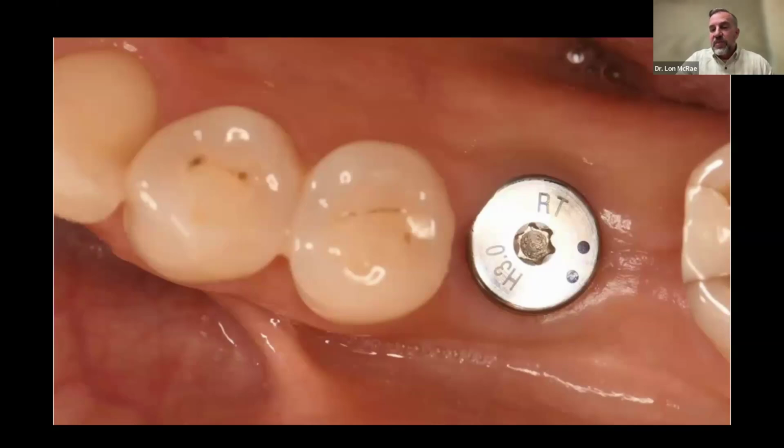And so that is the problem that we face when we do immediate. If we do a stage 1, we're going to be even worse than this. If we took this tooth out and we didn't place the implant, that mesial root area would be exactly like that distal area. That's exactly what that study is showing us. So is this a good scenario? This actually saved the patient because it would have been just like that in that mesial area if that implant hadn't been placed. But is that a problem?